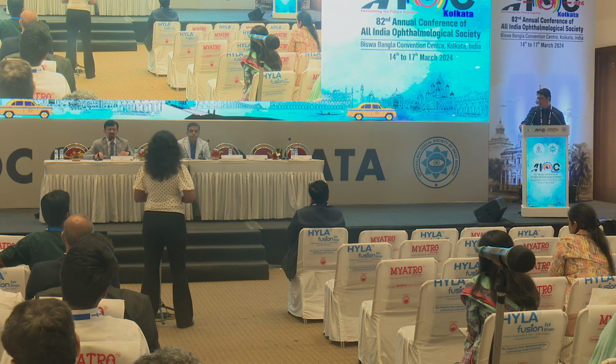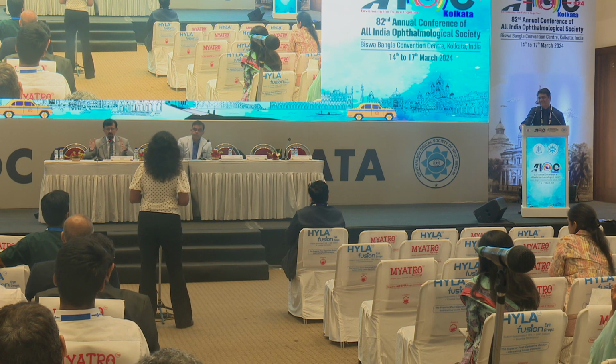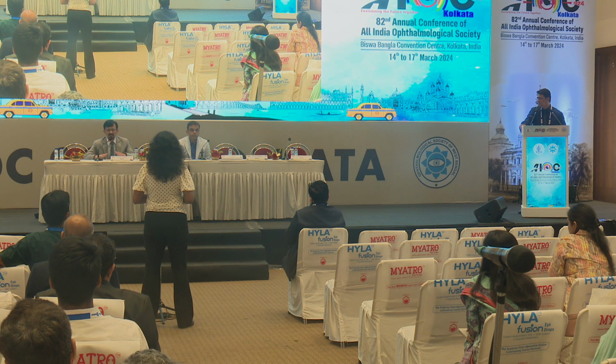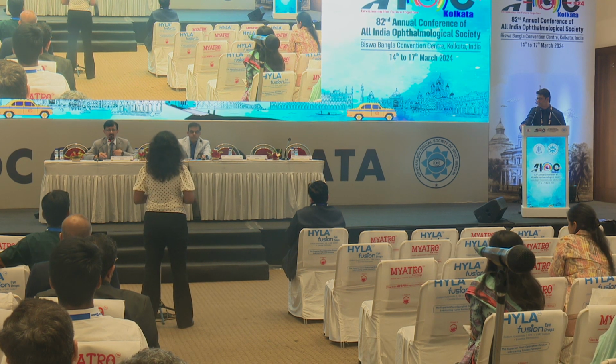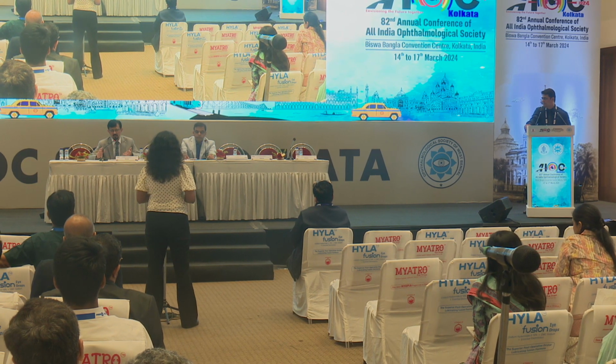I keep that. We have switched over completely to femtosecond, but when we were doing both, my criterion was more than 46. I would like the opinion of the panelists: if it's more than 46, I would prefer a femtosecond laser rather than a microkeratome because of the risk of flap buttonhole.